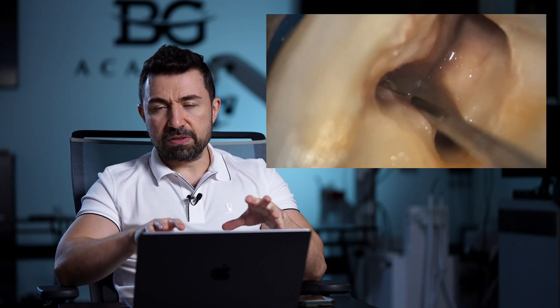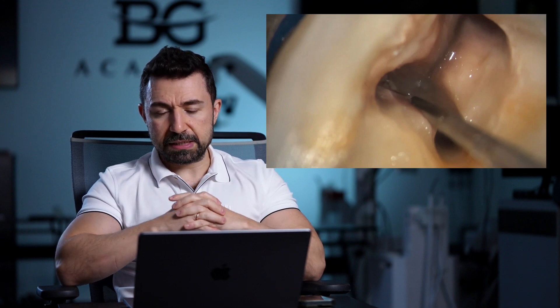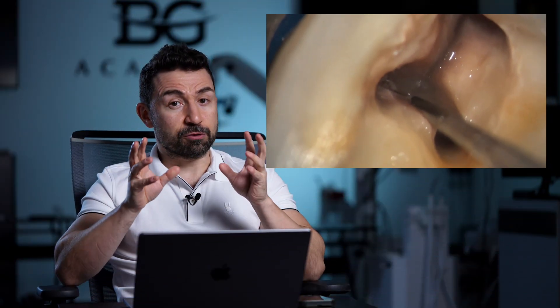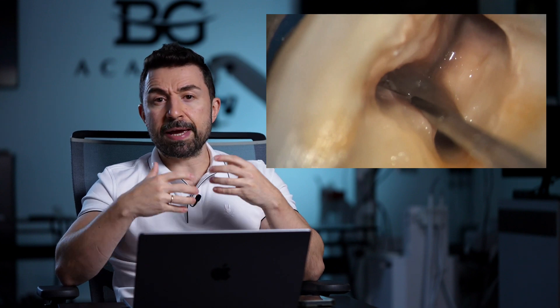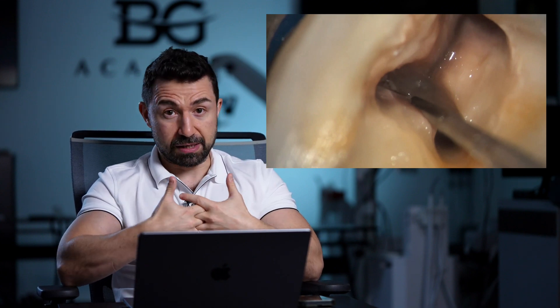After I removed everything — the old filling — I would like to show you this image, where you can see the isthmus between two root canals. This is a very strategic point for extra examination and actually extra cleaning, because in the isthmus we may find some extra root canals sometimes.